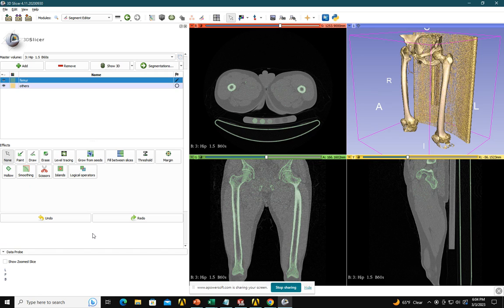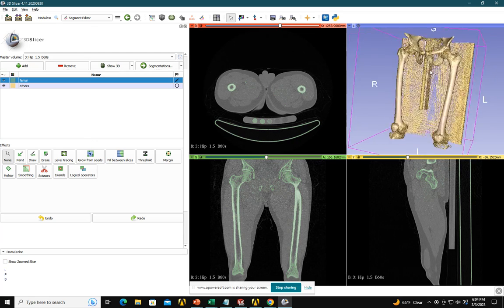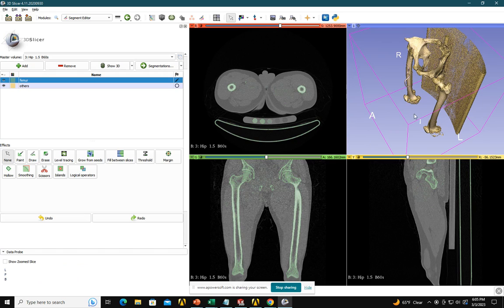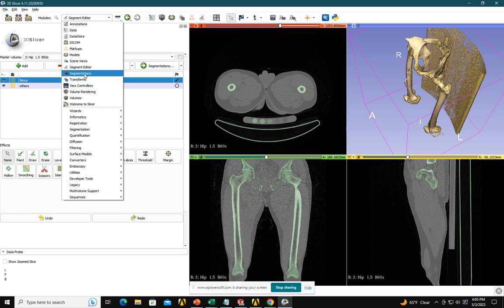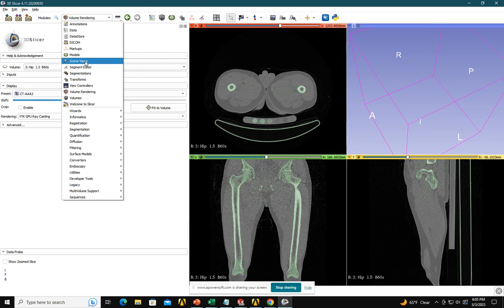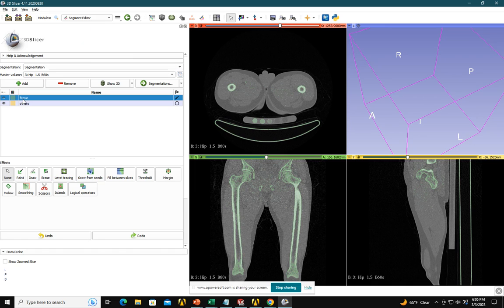Now I want to see the 3D view of what I have created. Right now this is just the volume-rendered 3D view, not the segmented view. To see the segmented view, I have to first remove this — I will go here on Volume Rendering and click here, so it's gone. Then I will go again to the Segment Editor. I want to see the 3D view, so I will click on 'Show 3D.' It will take some time.